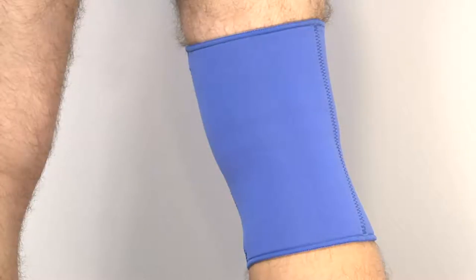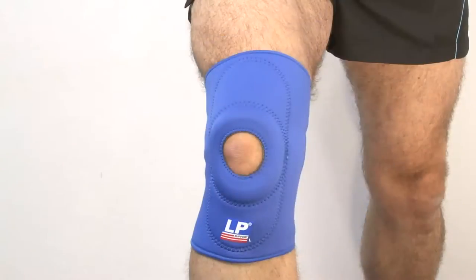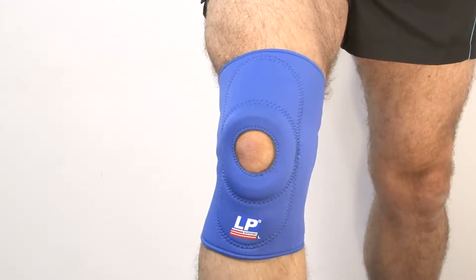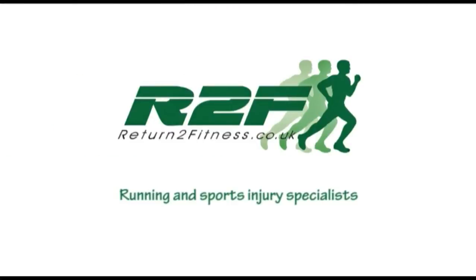Sizing information is based on measuring around the knee whilst in a standing position. For more information visit returntofitness.co.uk in the UK and returntofitness.net for the US and Canada.